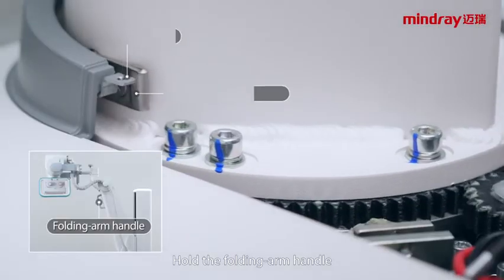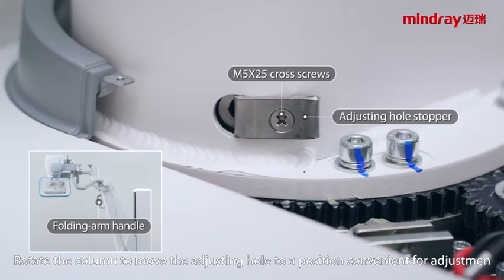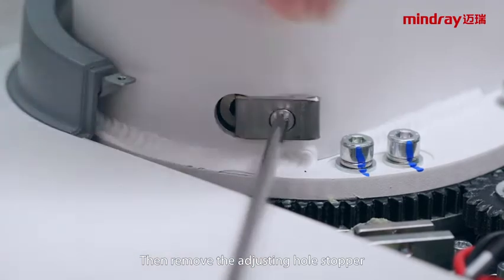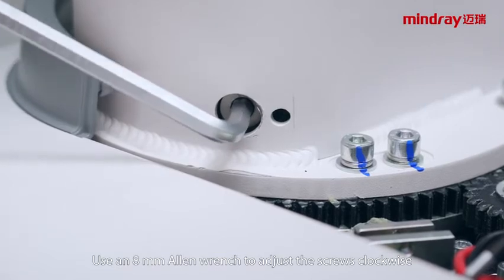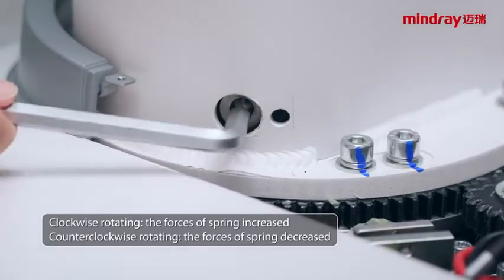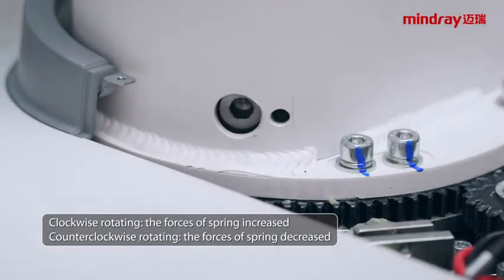Hold the folding arm handle and rotate the column to move the adjusting hole to a position convenient for adjustment. Then move the adjusting hole stopper. Use an 8mm Allen wrench to adjust the screws. Clockwise rotation increases the spring force; counterclockwise rotation decreases the spring force.